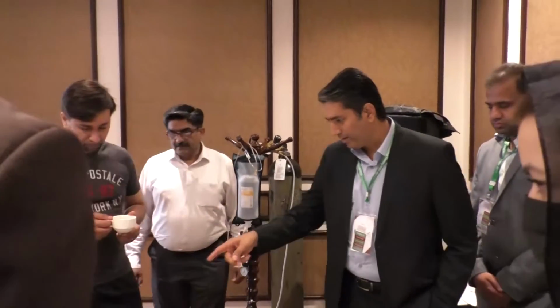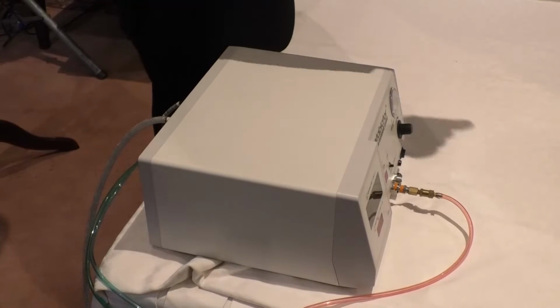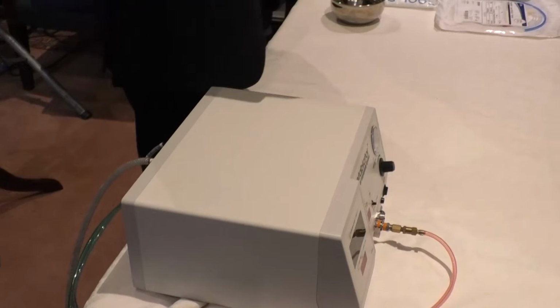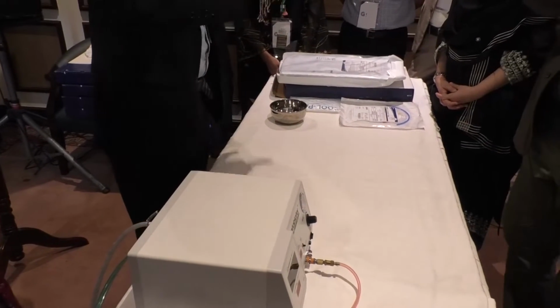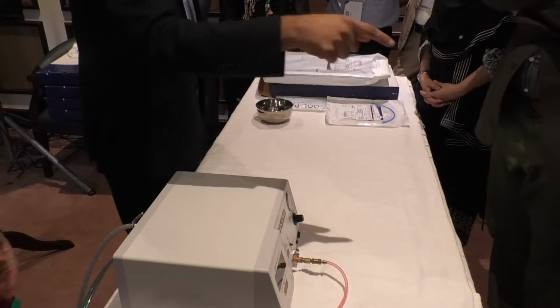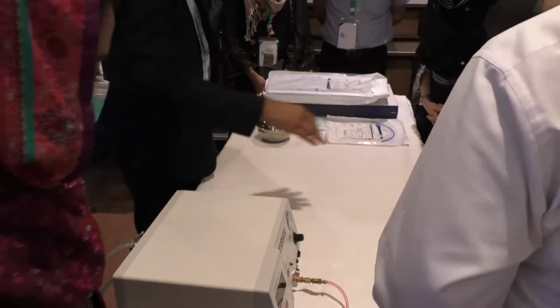Then this system, we will check the connection a little. Before going in the system, before pressing the Y connector to go in, okay, you check directly on the light and set it back on the rotations. Now I will tell you, Altaf sahab will guide them a little, how with a single press it changes its mode.